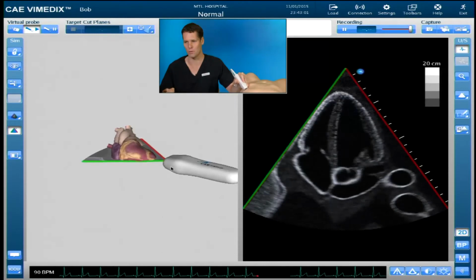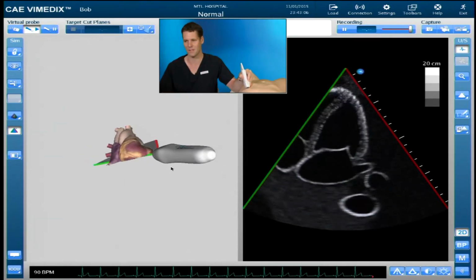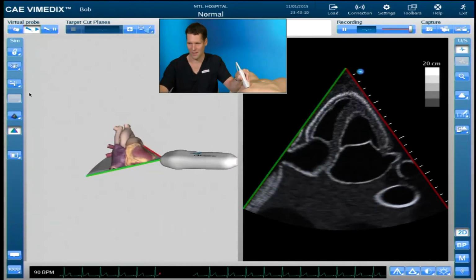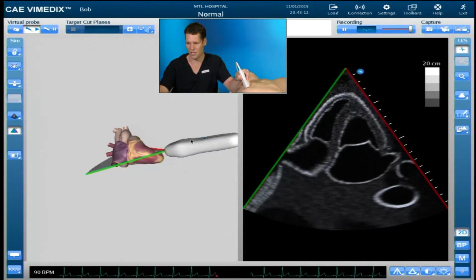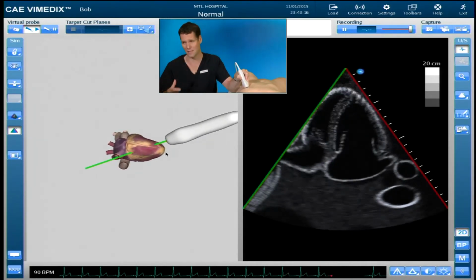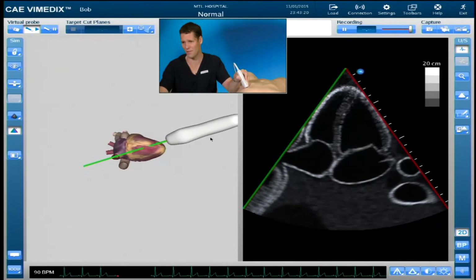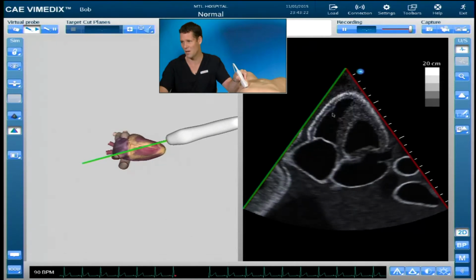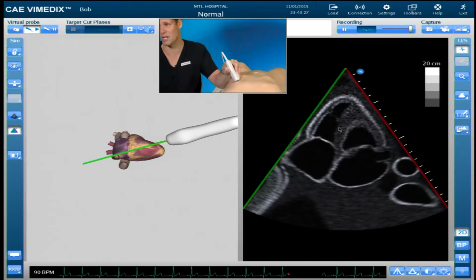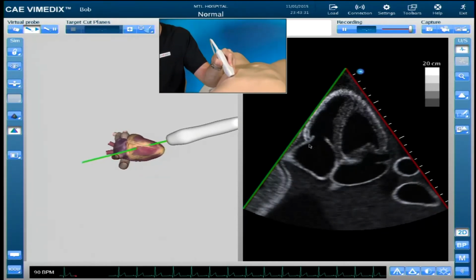What I mean by foreshortening the image is being maybe a rib space too high and imaging off axis. Okay, we want to be imaging from the apex of the heart. And maybe I can try and persuade you on this image that if we are imaging off axis, we can make this right ventricle look bigger than it really is, because it looks like it's almost the same size as the left ventricle in this image, because we are off axis.